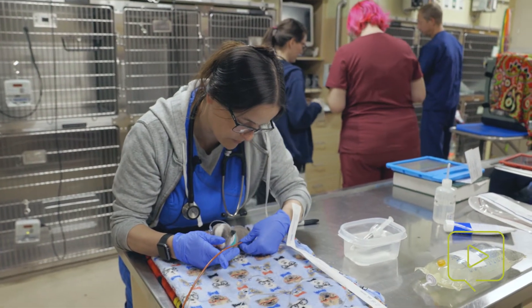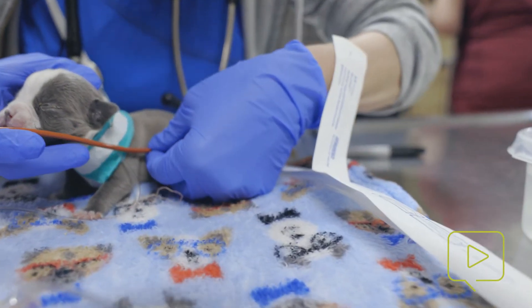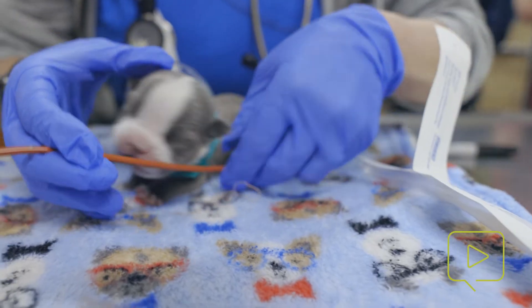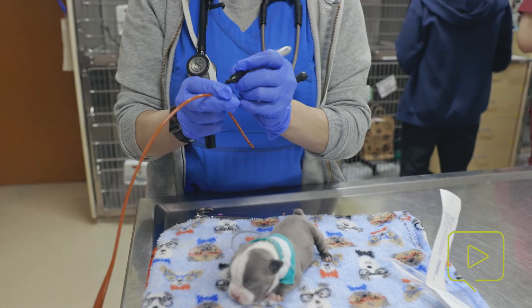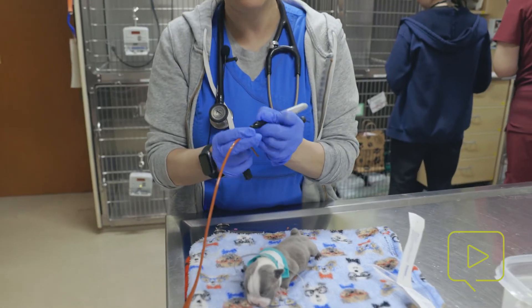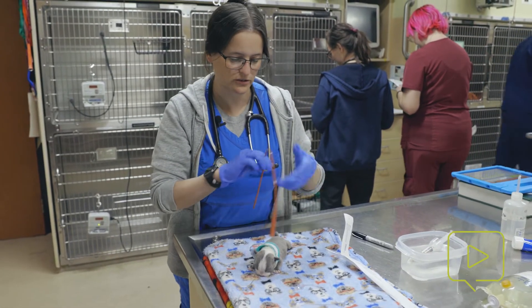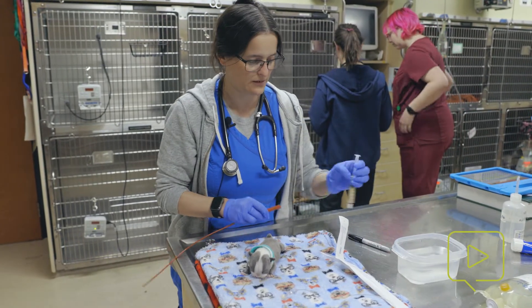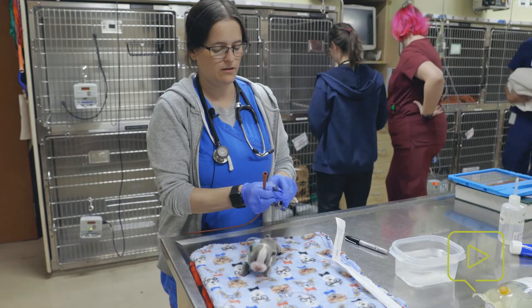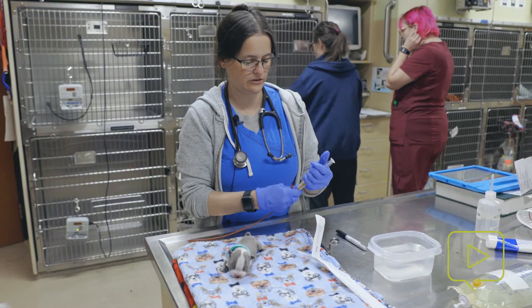You want to be as accurate as possible with this measurement. We're going to mark right here, and you can mark your tube with either a Sharpie or with tape. Sharpies will wash off eventually, but I like to use them because you can adjust your marking using the same tube even as they get older. With these tubes, you have to cut the fat end so that it will fit on your syringe.